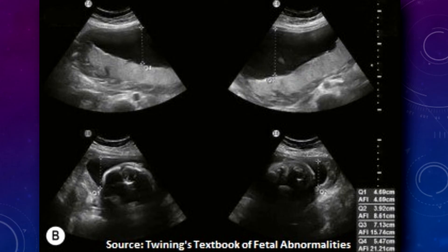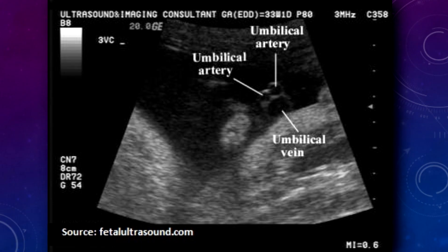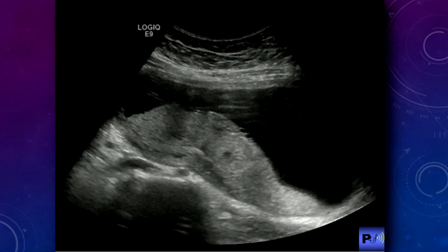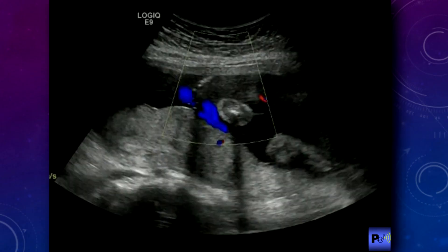You could also look at the umbilical cord within the amniotic fluid. Put color Doppler on it to show the vascularity, and get a transverse view to show the three-vessel cord. After that, you can assess the placenta again. At the beginning, we looked at whether it was posterior, fundal, anterior, or whether it was previa. Now you want to look at the placenta and see if there's anything like placental lakes or any masses. See where the placental cord insertion is, and also grade the placenta from zero to three.